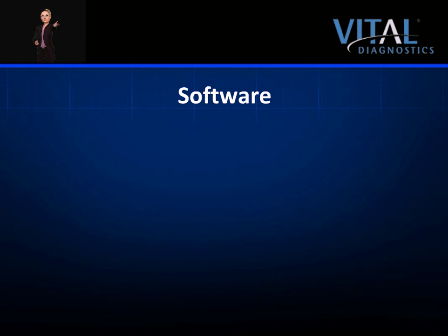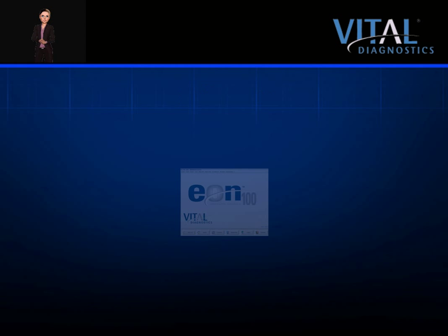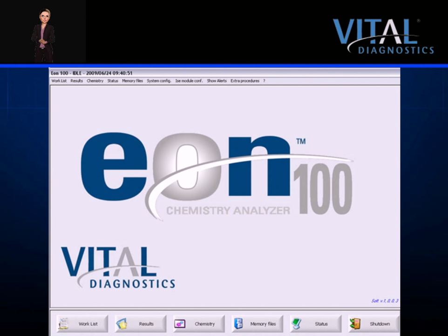We will now explore the EON100 software. The software is Windows-based, bright, and intuitive. Navigation is simple and most screens are accessed by only one click of the mouse. The large icons at the bottom of the screen indicate the most commonly used menu options, making navigation a breeze. These menu options are also displayed in the upper menu bar, along with less frequently used options.